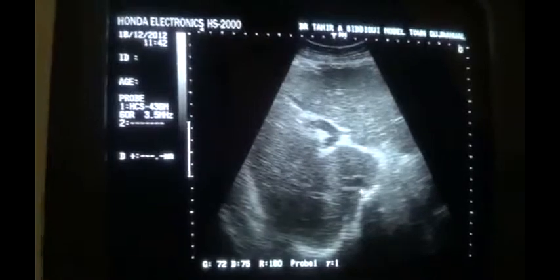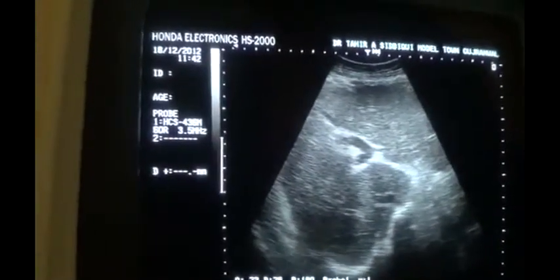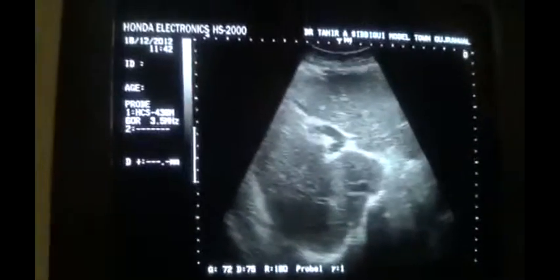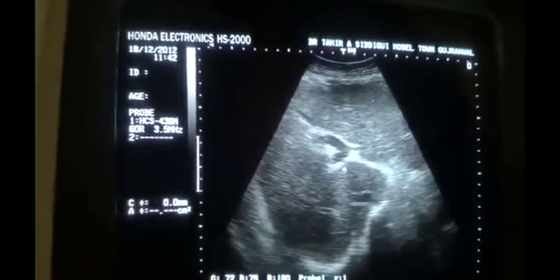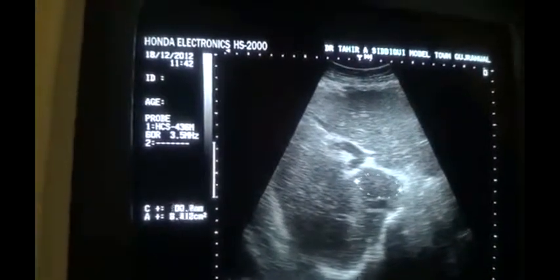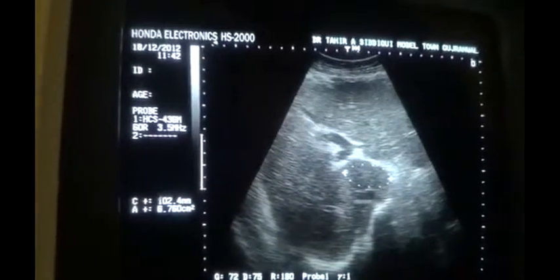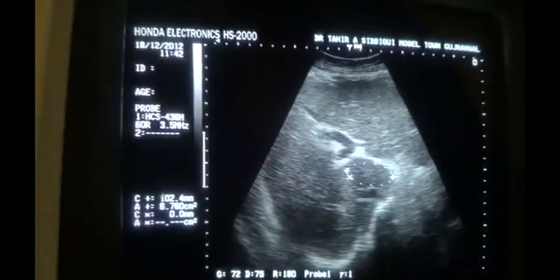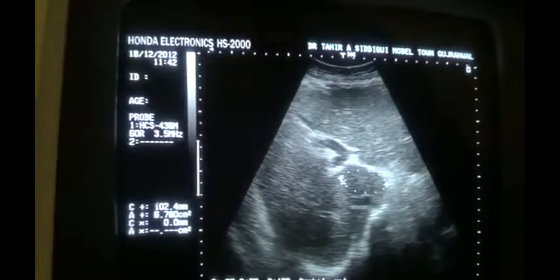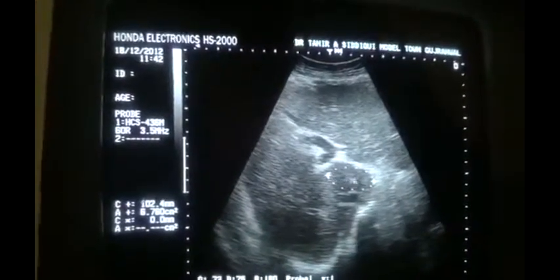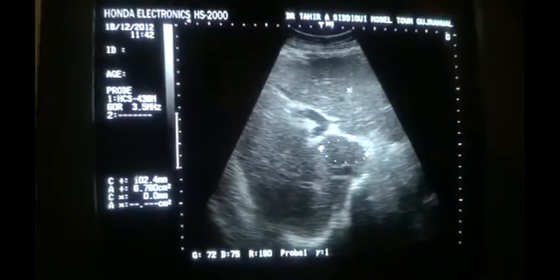This is the left lobe of the liver in transverse section. This is the ligamentum teres, this is the IVC, and this is the caudate lobe of the liver, or segment one. Remember that the echogenicity of the caudate lobe is really preserved in cirrhotic liver, because the caudate lobe has its own separate blood supply.